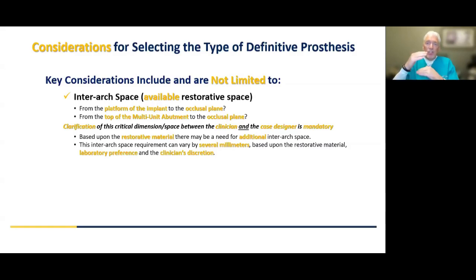If they don't have the space, you either open the vertical or reduce alveolar bone. Our laboratory has done thousands of these cases, and I've personally been in hundreds of these cases. A person with terminal dentition going into an All-on-X, on average, needs 3 to 5 millimeters of alveolar reduction to get to this ballpark restorative space.